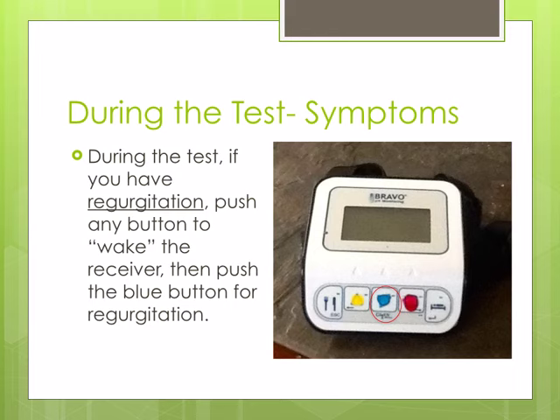To document regurgitation during the study, push any button to wake up the receiver. Then push the blue button to indicate regurgitation.